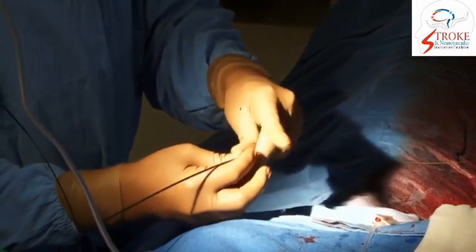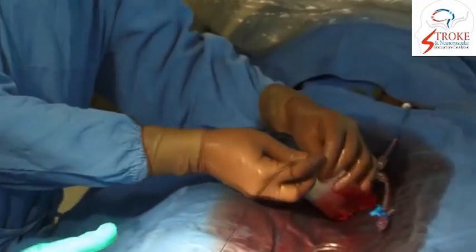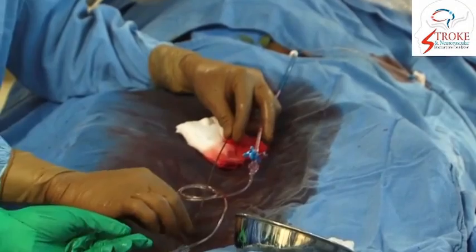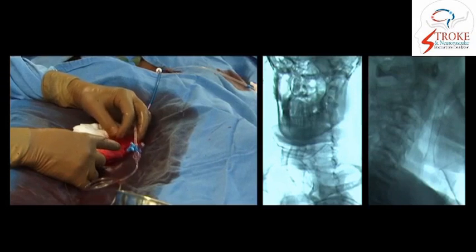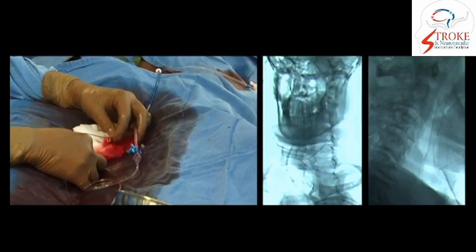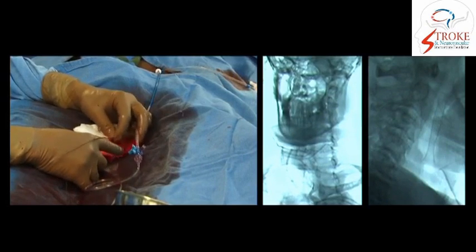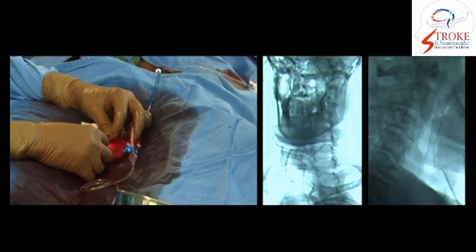Now the stent is being introduced into the guiding catheter. At all times we take care to keep the filter wire stable. So stent placement is done under fluoroscopy. In this case, because of the tortuosity, there was some resistance in passing the stent through the arch.